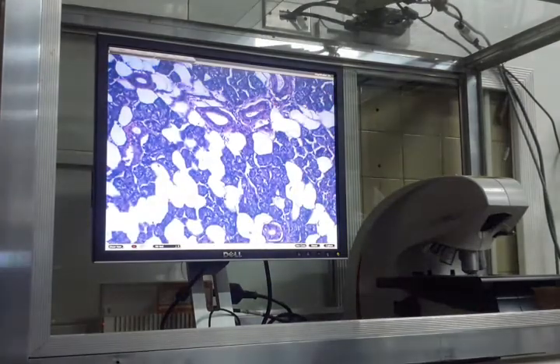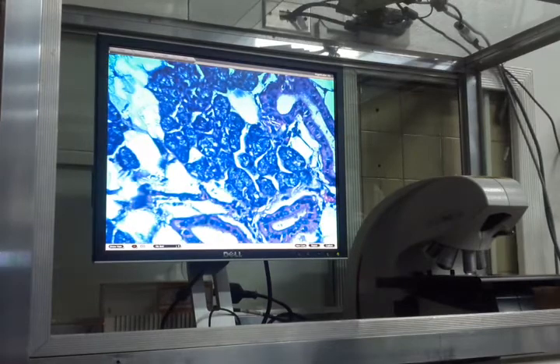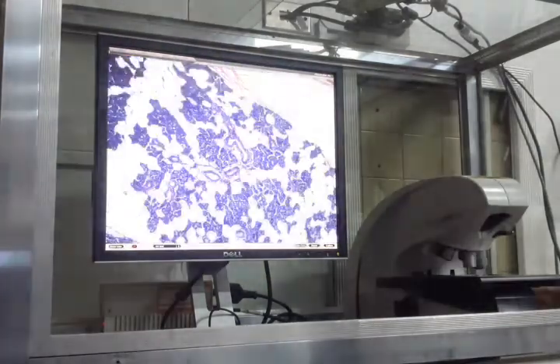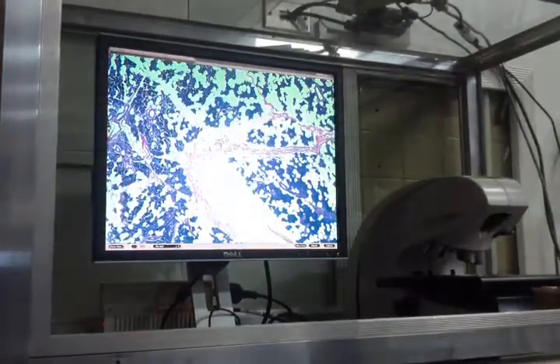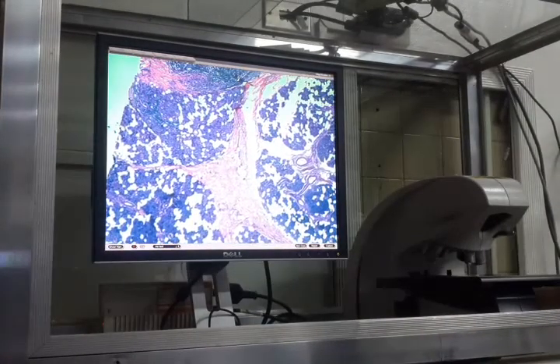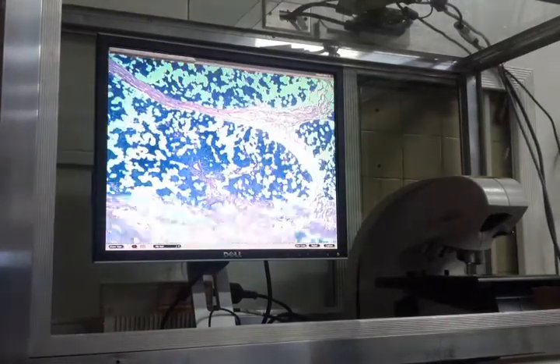This is the parotid gland. Those are serous acinar cells. Those are serous acini. And this is the duct tube. Okay? Parotid gland to. The pathology, besides the fatty infiltration, and that's a pathology in itself, you have fatty infiltration of the parotid gland. Beside that, mali yung sinasabi sa description.